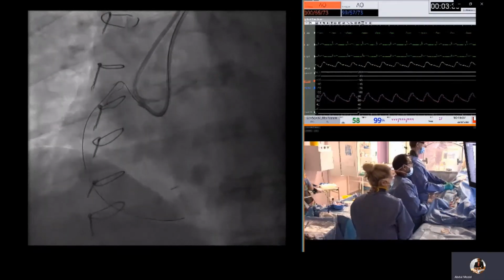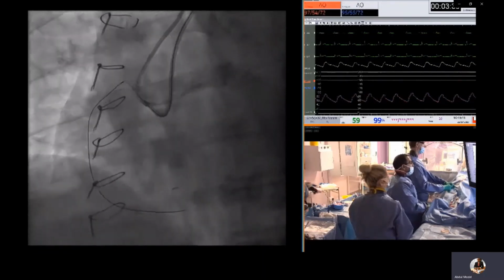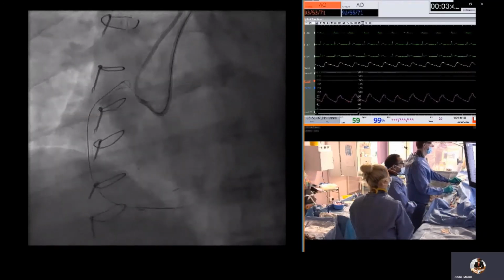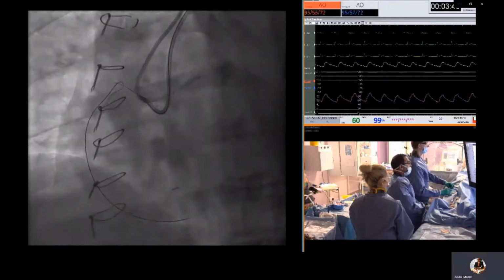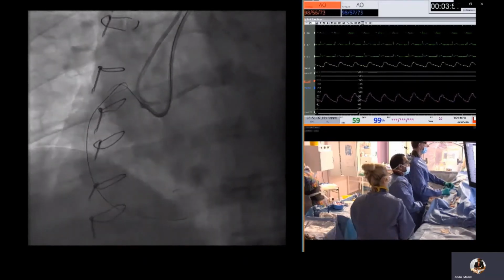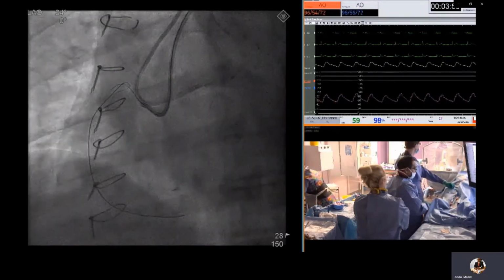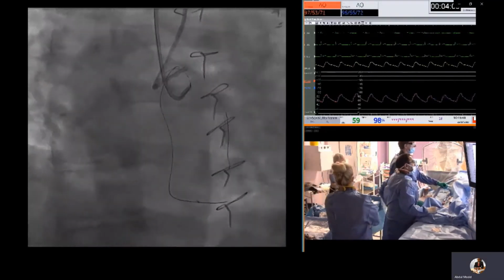So the initial plan, as we had so clearly defined the cap, was to directly puncture the cap with a Confianza wire, as we felt that we would easily be able to hopefully stay within architecture given the retrograde landmark. So here is a Confianza wire scratching the top of the proximal cap and appears to puncture accurately and appears to be in sync with the retrograde equipment.